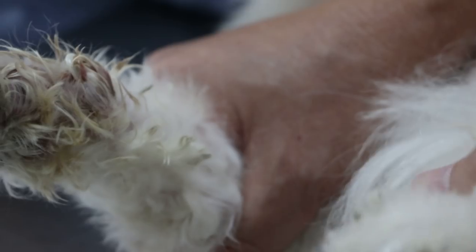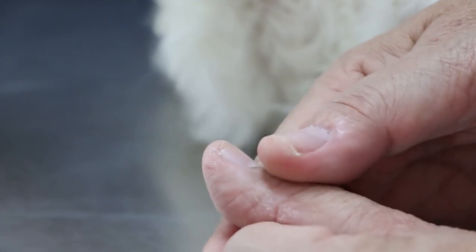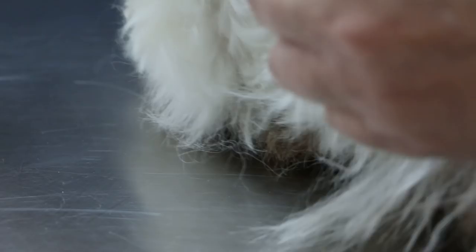Both — all four together. Or the other three as well. The whole thing — the thumb — cut it off. Oh, this thumb... no use? No, because the nail will grow into the flesh. Do you see the nail? It grows into the flesh — it's overgrown already. Correct.